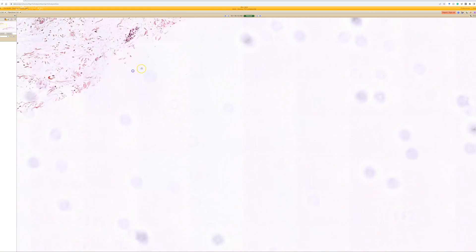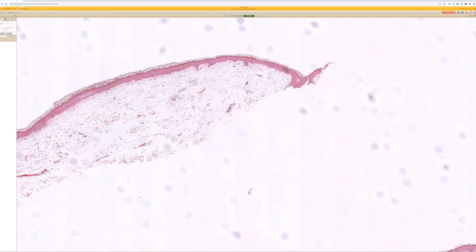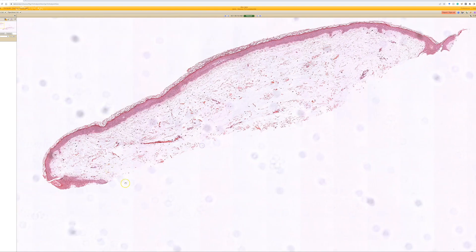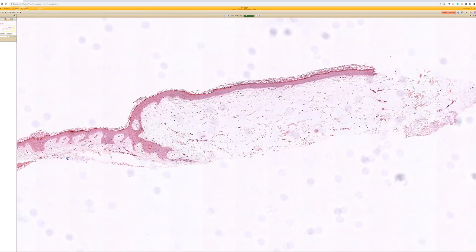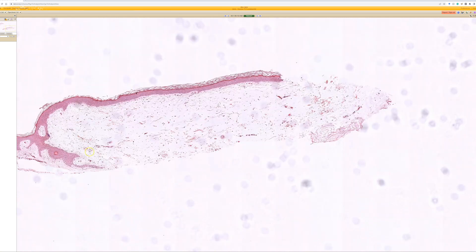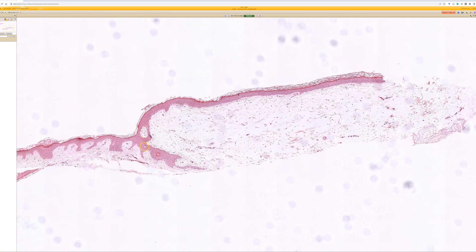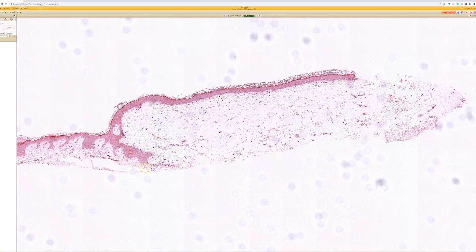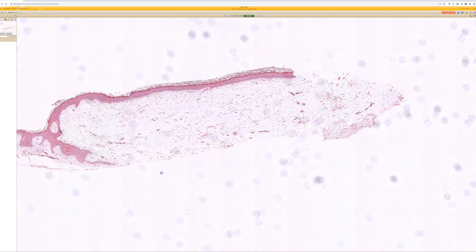Here, you can tell it's just a little tiny nodule of it microscopically. It's so small that clinically, this probably just looked like a single papule. And you can see there's also a little collarette where there's an eccrine duct and some elongated epithelium that's scooping down under the lesion. Sometimes this will have that.